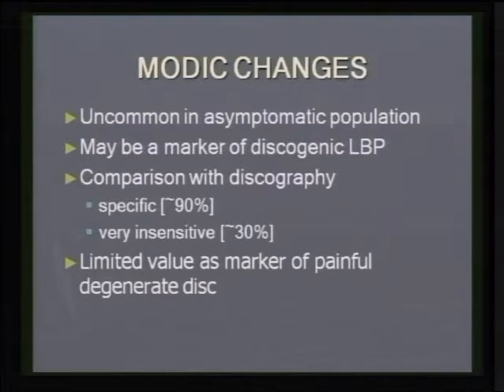Now, what we have found in terms of literature search and research as far as Modic changes are concerned is that they're actually very uncommon in an asymptomatic population. So it is suggestive of being a marker of a degenerate disc.